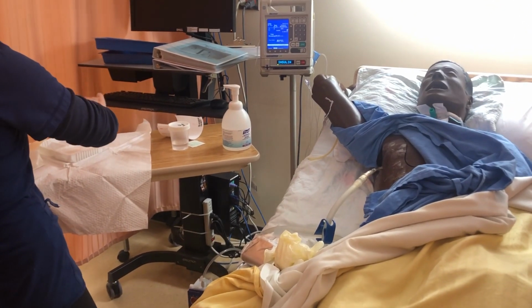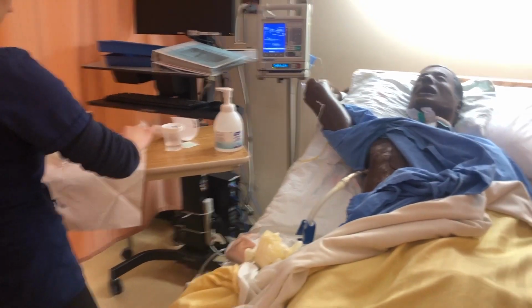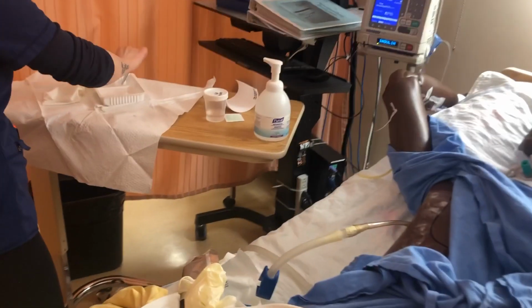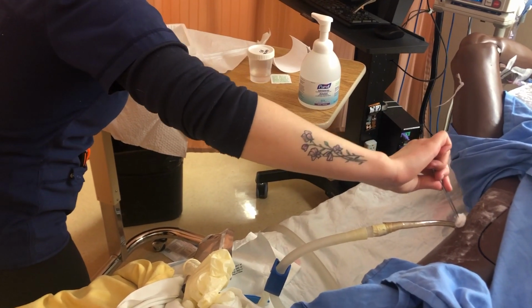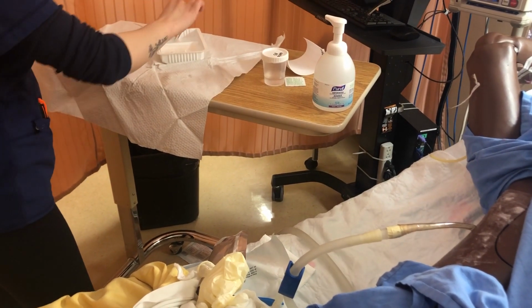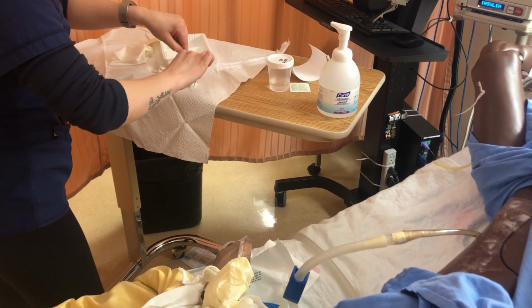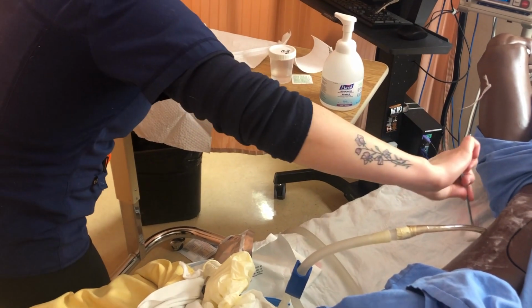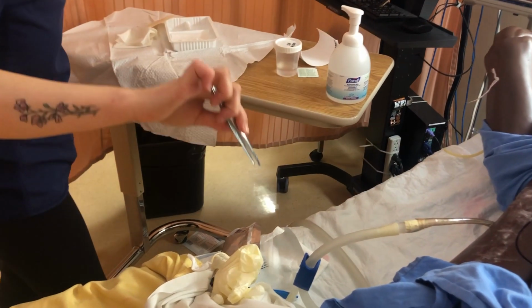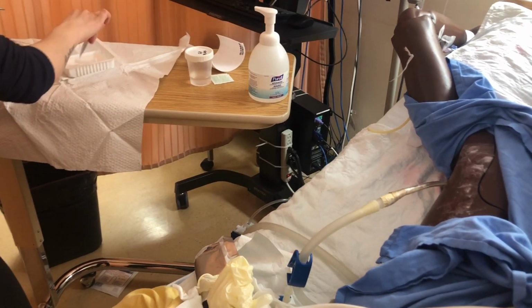So using my forceps, we'll make some rosettes. Dip the normal saline. And using one swipe, I'm going to clean around the site. And around again. I'm wanting to clean around the entire area that is going to be under the dressing.